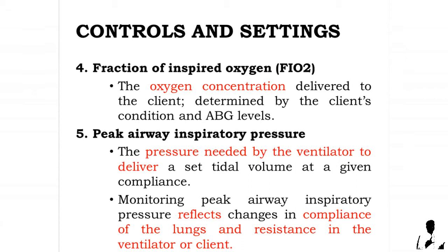5. Peak airway inspiratory pressure. This is the pressure needed by the ventilator to deliver a set tidal volume at a given compliance. Monitoring peak airway inspiratory pressure reflects changes in compliance of the lungs and resistance in the ventilator or client.